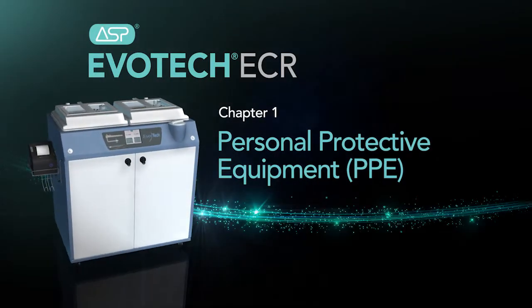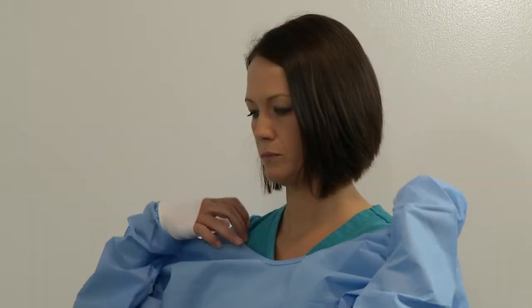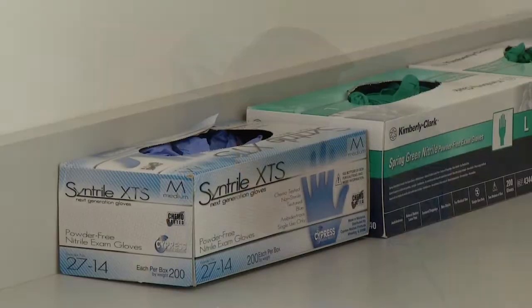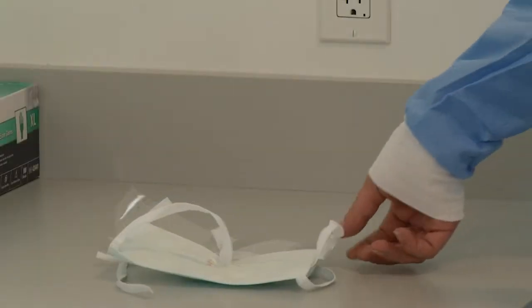Personal protective equipment should always be used by all personnel according to your healthcare facility's procedures. PPE includes a clean fluid-resistant gown, clean chemical-resistant gloves, and eye protection with a face mask.